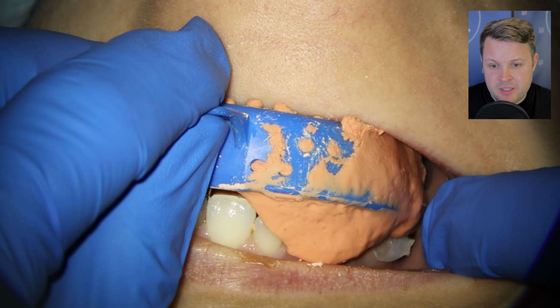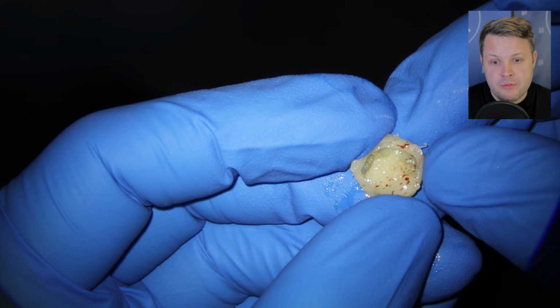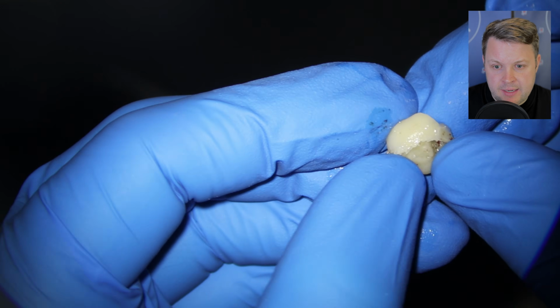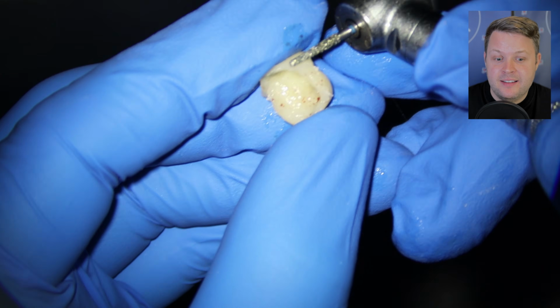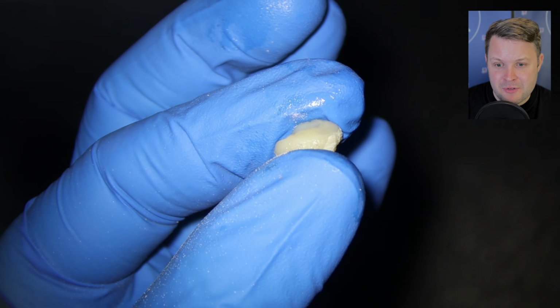You can see that we've got a temporary here, and there's a bit of flash around the edges, and it looks a bit rough. What I do is get the patient to sit up and have a little rinse around while I'm adjusting this, and that's a nice little break for them. I don't know if you've ever sat in a dental chair before, but sitting for these sorts of things can be quite difficult.